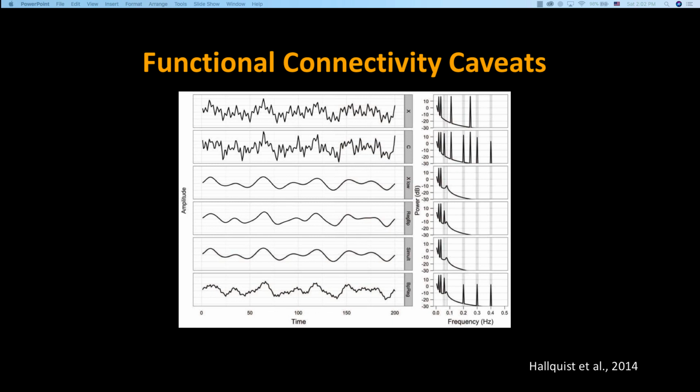So I bandpass filter the data, and then I try to regress out my motion regressors. Those motion regressors can still contain information about these frequency bands. Does that make sense? Because the confound regressors haven't been bandpass filtered, just the raw data has. If it doesn't totally gel, don't worry, because it is done as a default for you in the CONN toolbox. They do regression and then bandpass filtering.